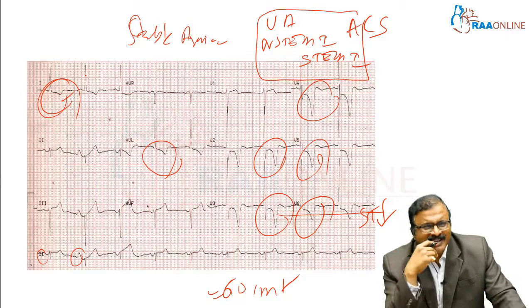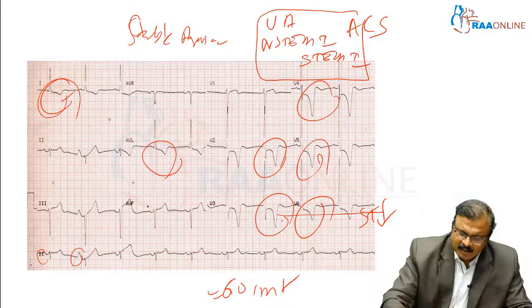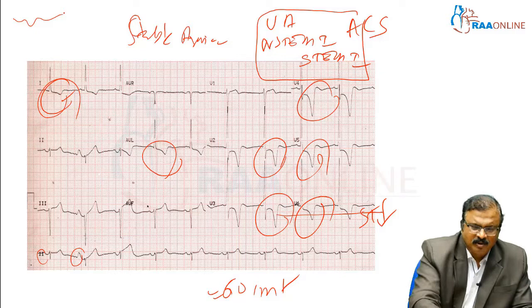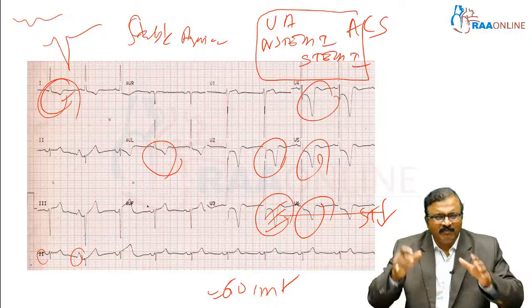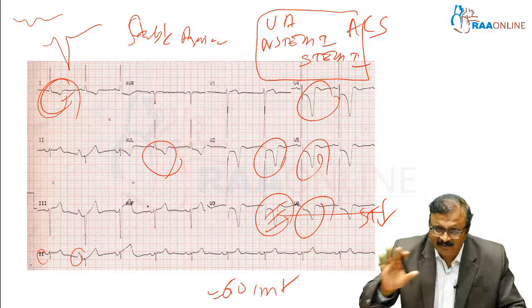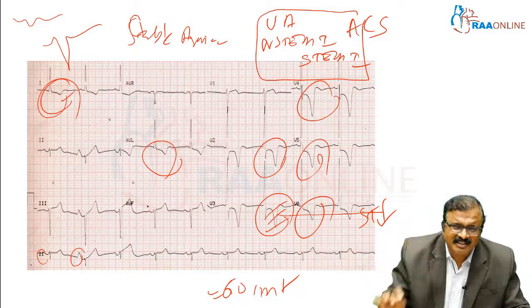The next important finding is comparing with lead AVL — you can see deep T inversions. T inversions can be mild or deep; here it is deep T inversion. When there is deep T inversion and ST segment depression, it is definitely not ST elevation MI — it is either unstable angina or NSTEMI.